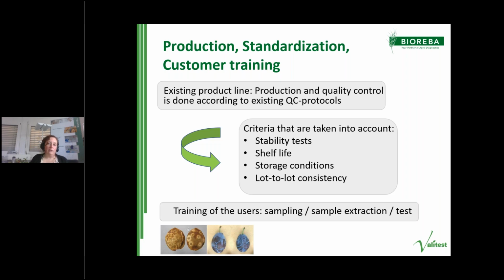And then we are also very happy to assist in training of users, but please remember that the protocol and the test, the lateral flow test itself, is half of the test. The other half is sampling and sample extraction, and the user should also be trained for this.